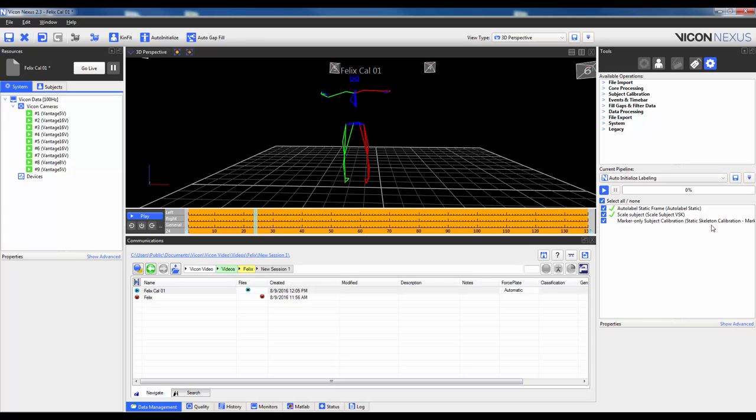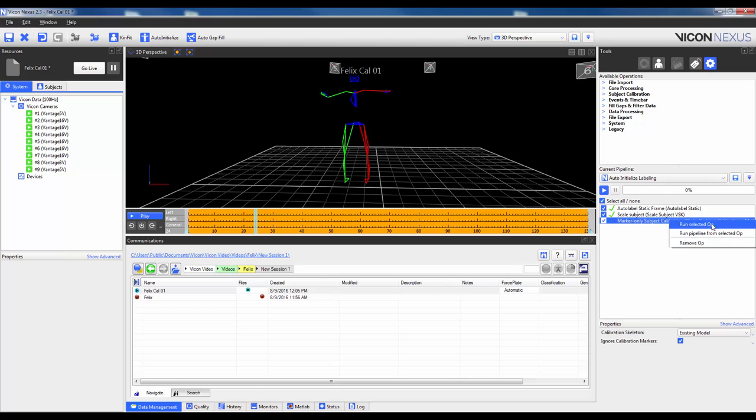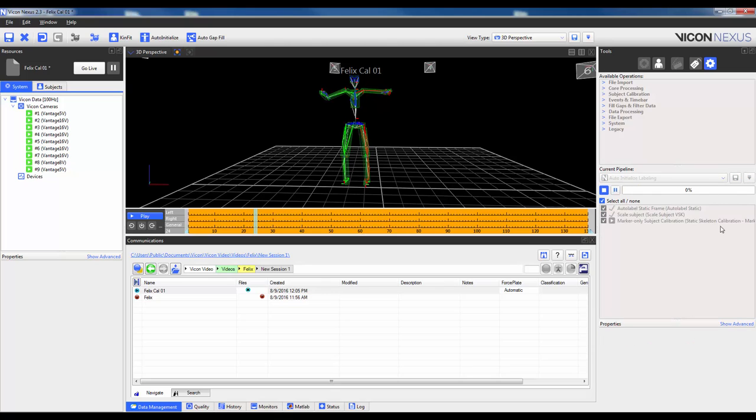Lastly, I will go in and run the marker-only subject calibration, and this will actually save the marker locations relative to its parent joint, and you'll actually see the kinematic segments appear.